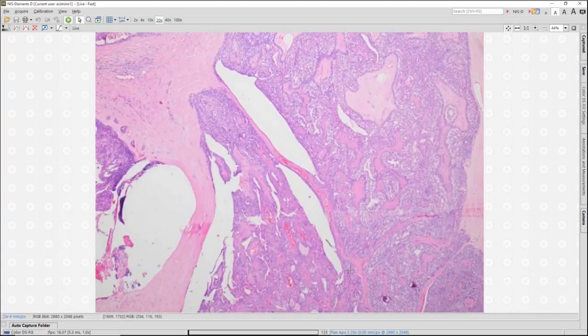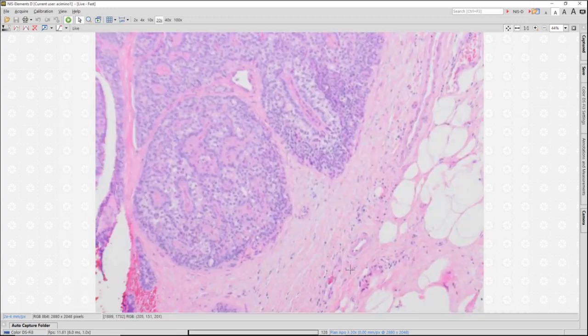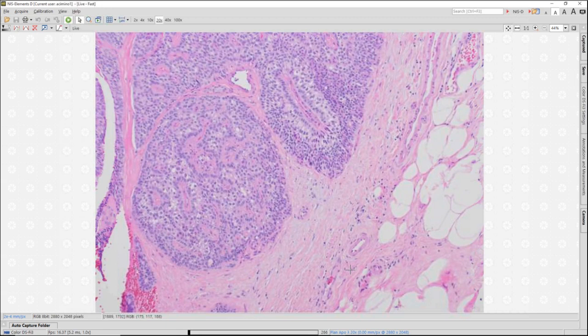And in general, although these are also benign, just like intraductal papillomas, these are still being recommended for excision because the long-term follow-up of leaving them in the breast without excision is not known. But surgical excision is the management, and they don't require any additional treatment. So in addition to just the epithelial cell, we have an expanded myoepithelial cell component.